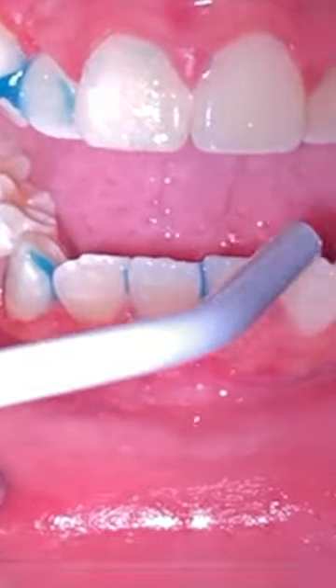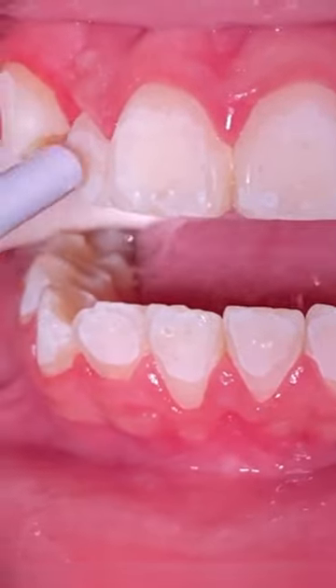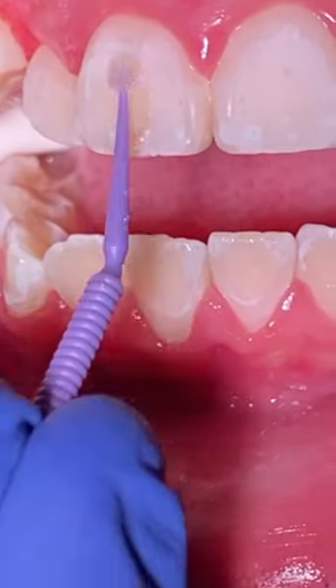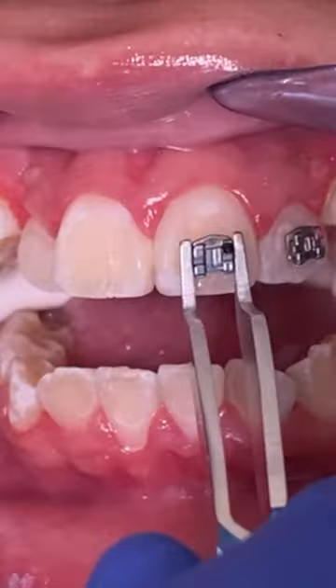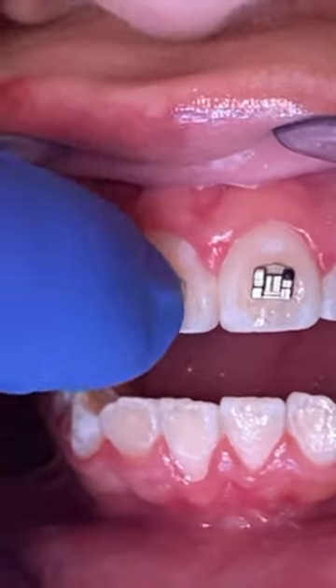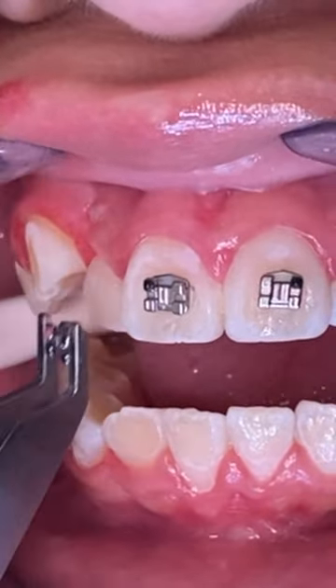So we go ahead and we apply some of the etch. We remove it, make the teeth chalky. We then apply some of the bonding material — it's just allowing the brackets to adhere to the tooth a lot more better. Then we'll place our wires and place our rubber bands.